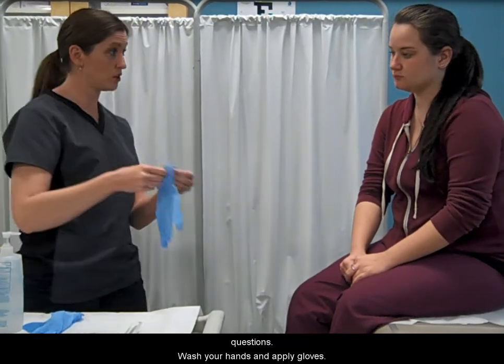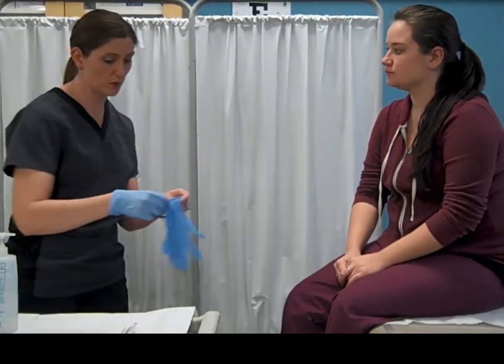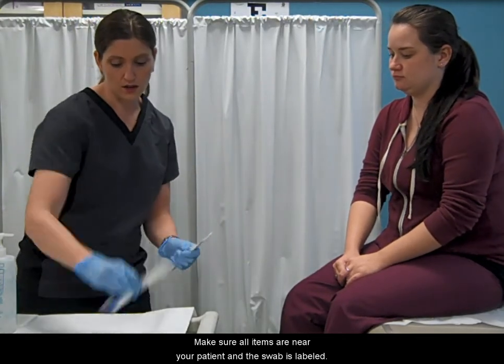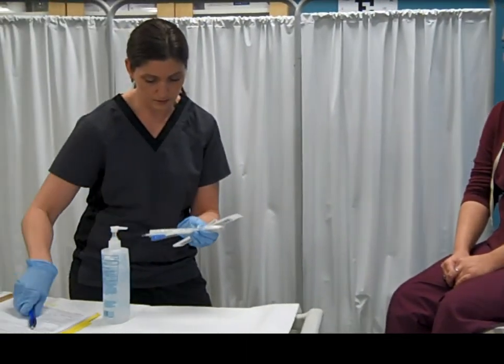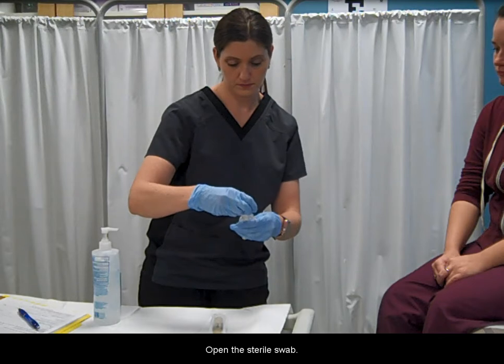Wash your hands and apply gloves. Make sure all items are near your patient and the swab is labeled. Open the sterile swab.